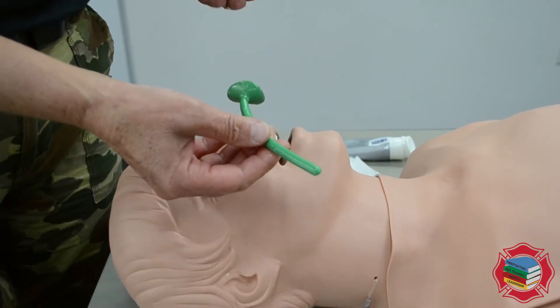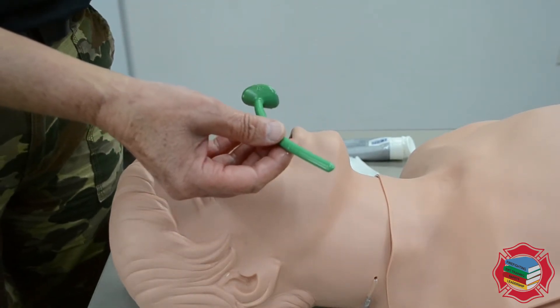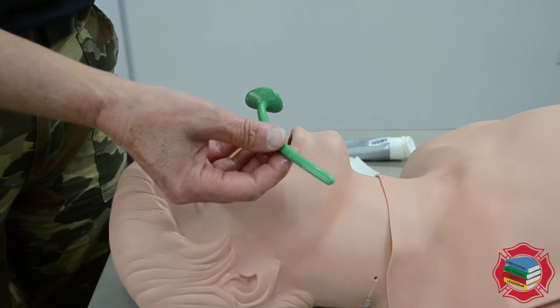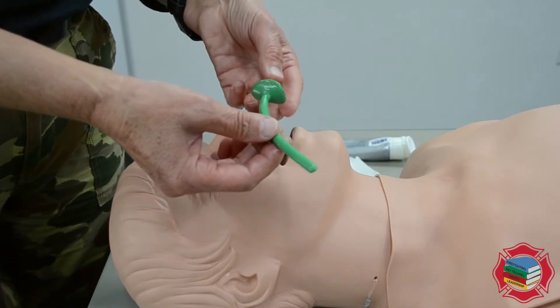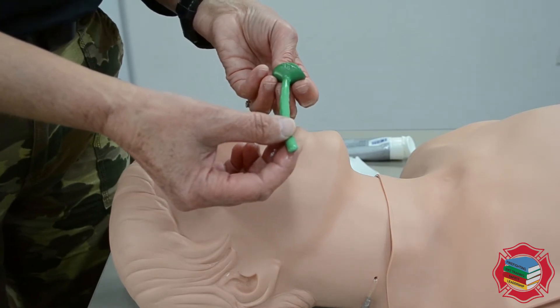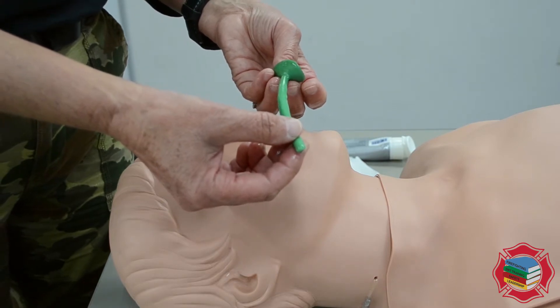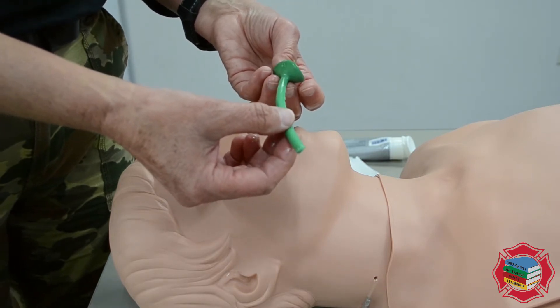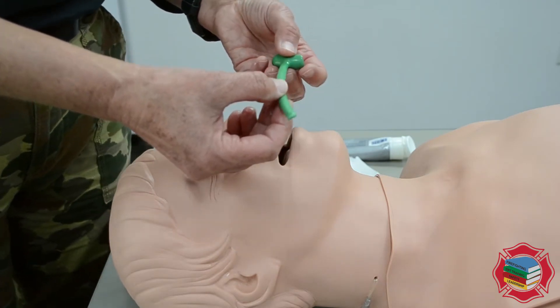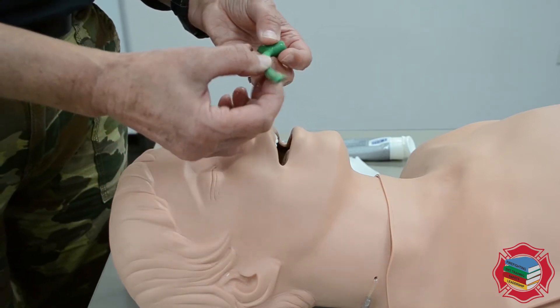This is your NPA — a nasopharyngeal airway. This is an airway used to support the airway by keeping the tongue off the back of the throat. This airway would be used on a patient who was perhaps unresponsive but retained a gag reflex, or a person who was responsive to pain who also had a gag reflex.